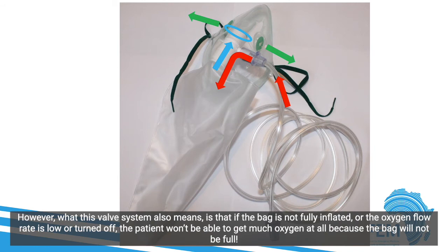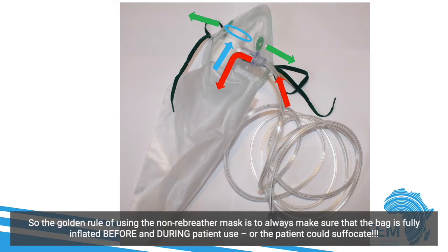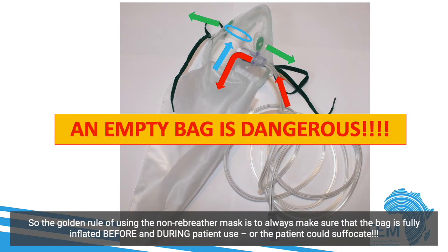However, what this valve system also means is that if the bag is not fully inflated or the oxygen flow rate is low or turned off, the patient won't be able to get much oxygen at all because the bag will not be full. So the golden rule of using the non-rebreather mask is to always make sure that the bag is fully inflated before and during patient use, or the patient could suffocate.